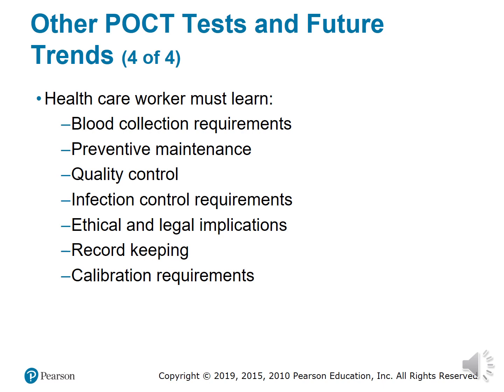Record keeping. Make sure when we are doing quality control as well as patient documentation of refusal, we do proper record keeping of said test that the patient has either refused or we did quality control over. We have to document.